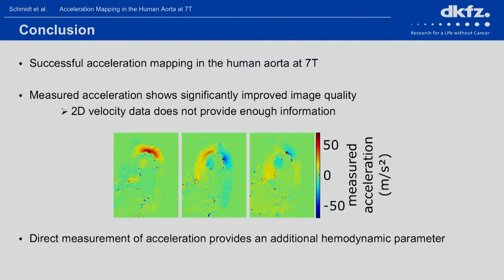data calculated from our measured velocity data, which is partly due to the fact that we could only acquire 2D velocity data. This direct measurement of acceleration now provides an additional hemodynamic parameter also at ultra-high fields, which might be beneficial in clinical situations.